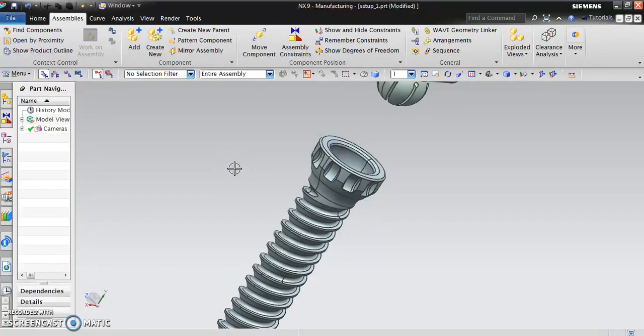The thread system needs to resist all the axial load that acts upon the implant. All the pull-out forces that will act on the human body as it recovers after the surgery, we need to resist. So these buttress threads are designed such that the load and the clearance flank, instead of having a V 60-degree inclusive thread angle, have 45 on one side and about 2 to 5 degrees on the other side. Sometimes some manufacturers prefer to keep it 0, but when they keep it 0 on the top side, it's tough to come up with a cutting tool that will cut that side of the flank without any clearance for the chips to evacuate. So it's highly critical that chip control is done right to make these implants without compromising on tool life.